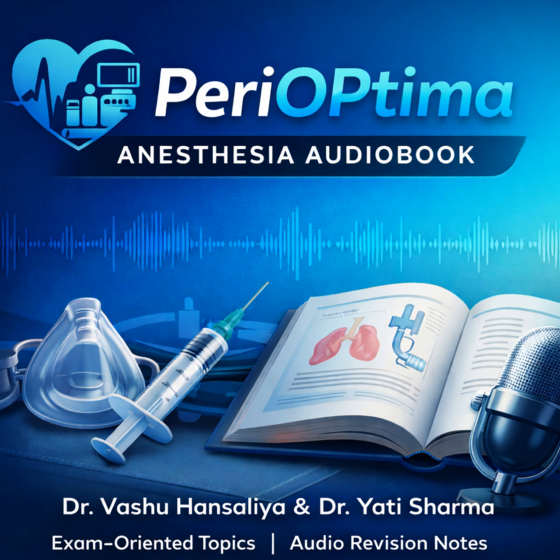Okay, so let's break this down systematically the way I'd have to structure it in a theory paper. We usually start with principles. Yeah. This is why I often get a bit bogged down in the physics. But the big dichotomy seems to be invasive versus non-invasive. It is, and the exam question here usually revolves around that risk-benefit ratio. We're always trading patient comfort and safety for data accuracy. Okay. Non-invasive is safe, it's easy, and it's usually intermittent. Invasive is continuous and highly accurate, but it carries real risks: infection, thrombosis, pneumothorax. The art of ICU is knowing when the patient is sick enough to justify the risk of that invasive line.